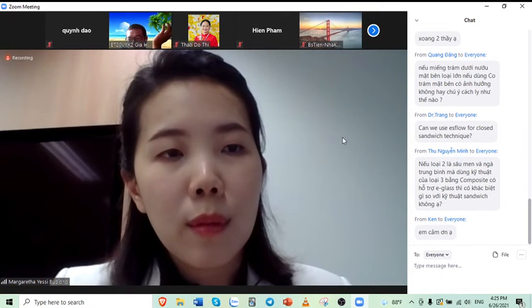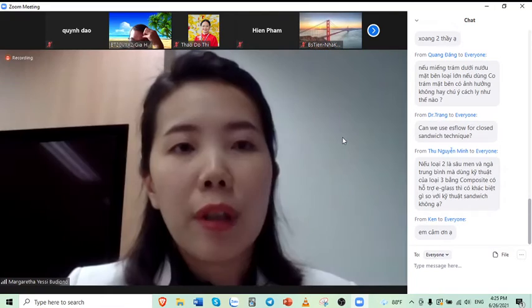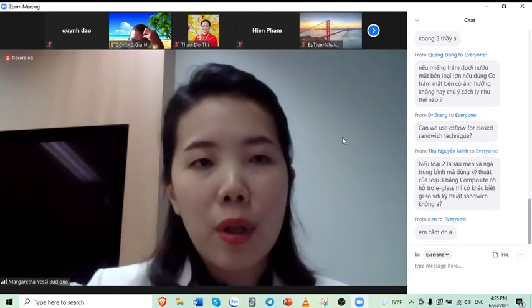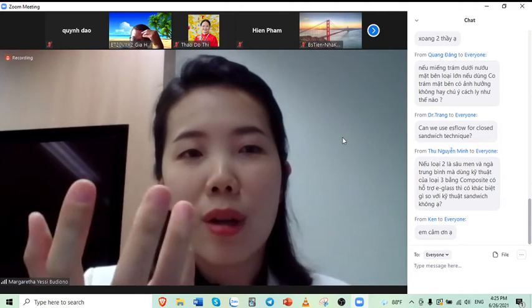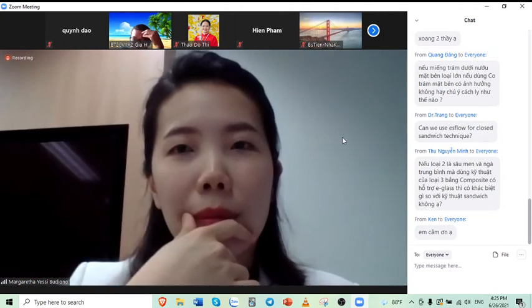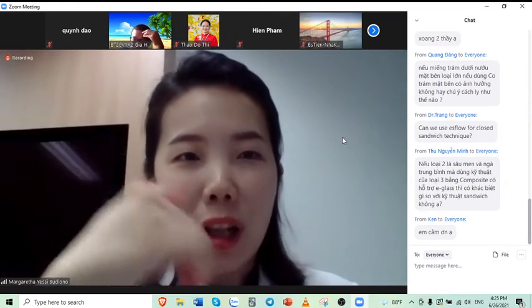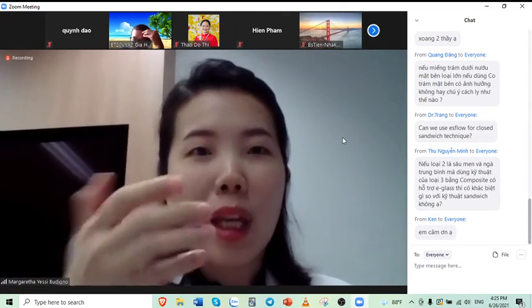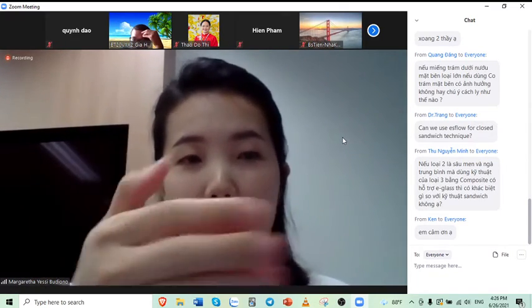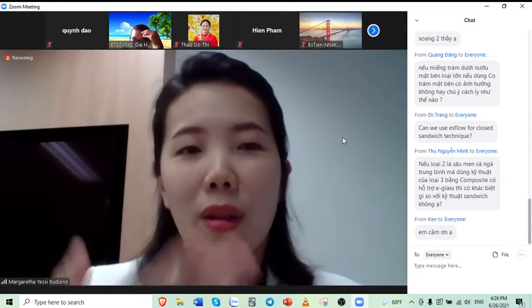Do we have to pay attention to the isolation or something? Yeah, I think one of the challenges if you put a composite restoration on a cavity that is below the gum is the isolation, because if there is saliva contamination, it will affect the bonding strength. Also, one thing to note is whether we can polish this composite surface or not. So those factors have to be considered as well.